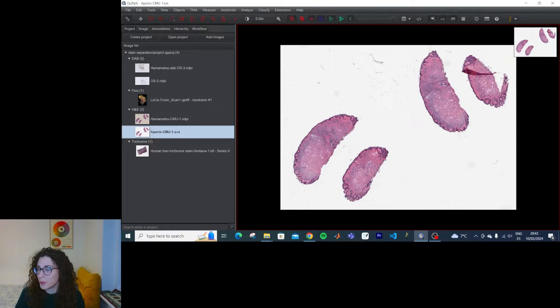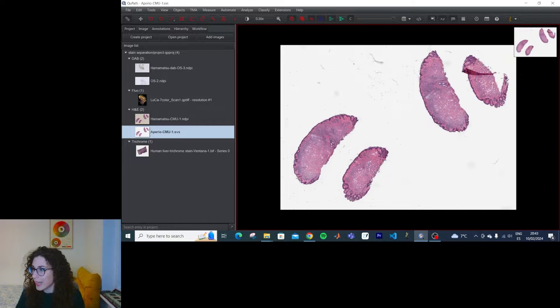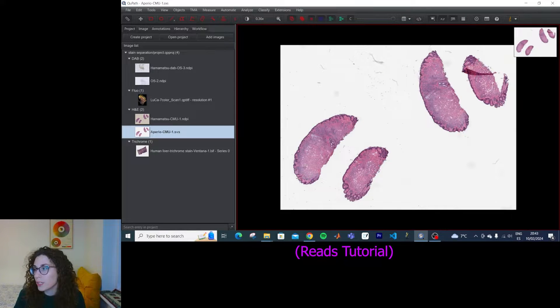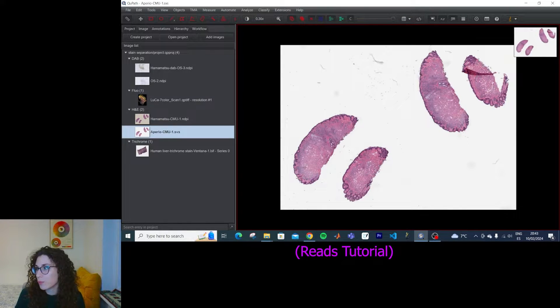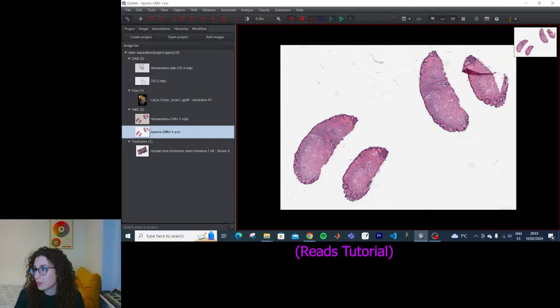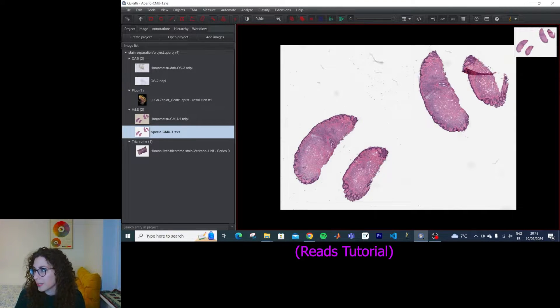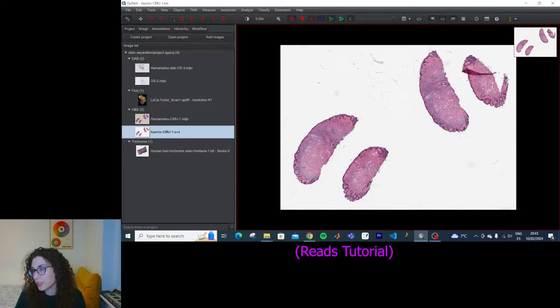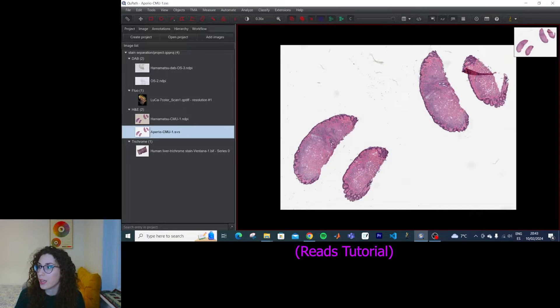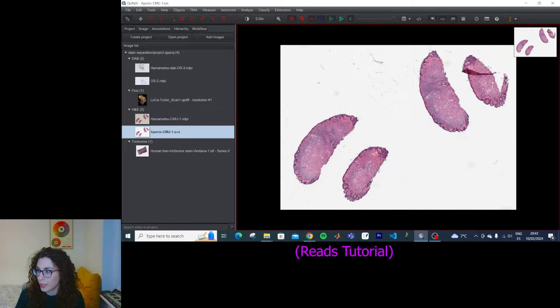Okay, so what does this say? Why do I need to know this? Thresholding may become one of the QPath commands that you use most often. It provides a way to define regions of interest without needing to manually annotate everything.